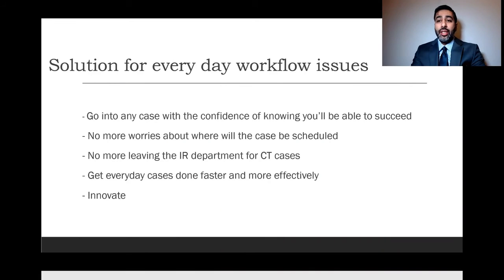So I really just wanted to get into how this solves our workflow issues. Really what it gives me is the confidence and the ability to go into any case knowing that I can ultimately get it completed without any issues.